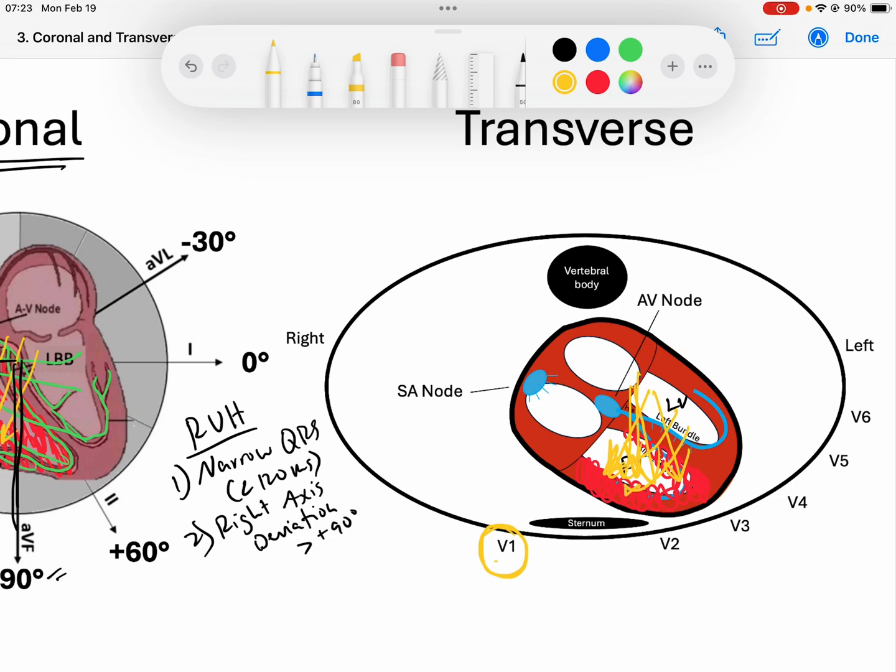When those forces turn into the right ventricle, we really see those in V1. V1 will have a significantly positive QRS complex. That's usually not the case because the usual vector of depolarization is away from that towards the left ventricle. But in this case, my right ventricle is hypertrophied, so we will have a tall R wave. That R wave will be greater than 7 millimeters.